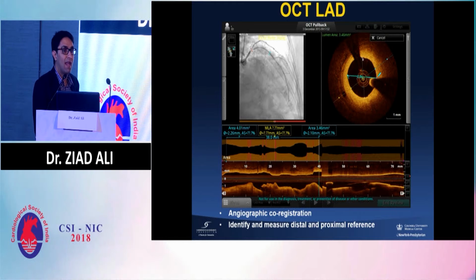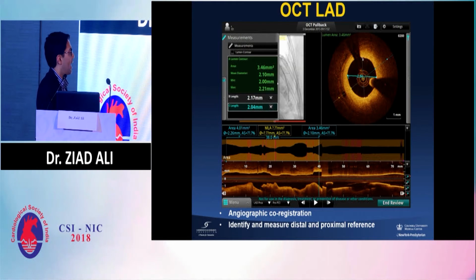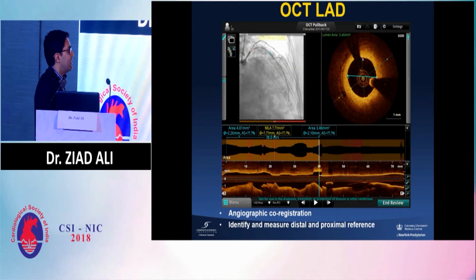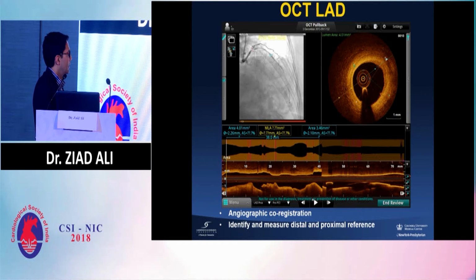And that means that I'm going to have to post-dilate based on the angio after I implant my 3.0 stent. But you see the difference between lumen-guided and EEL-guided stenting. If we were to use the lumen, we put a very small stent here.